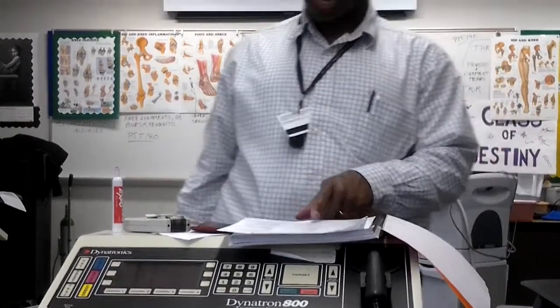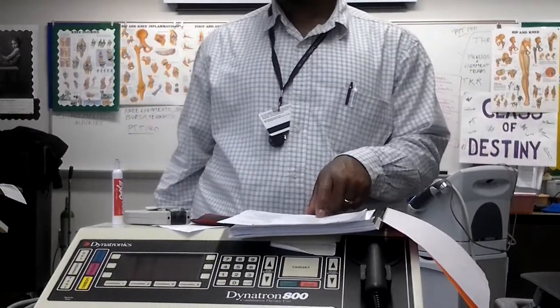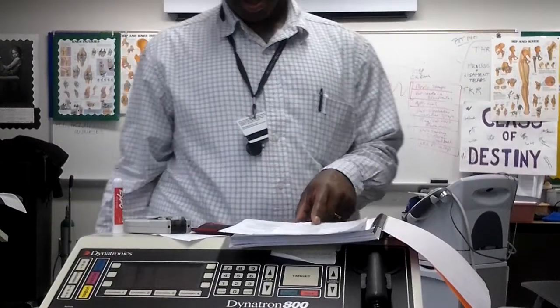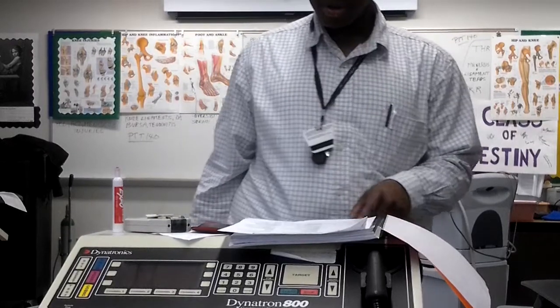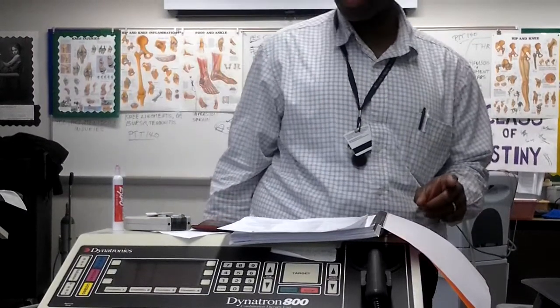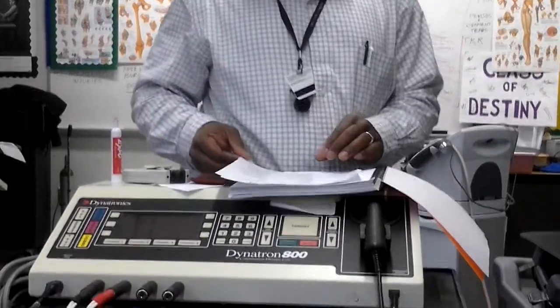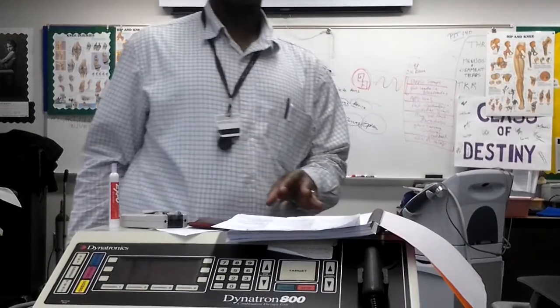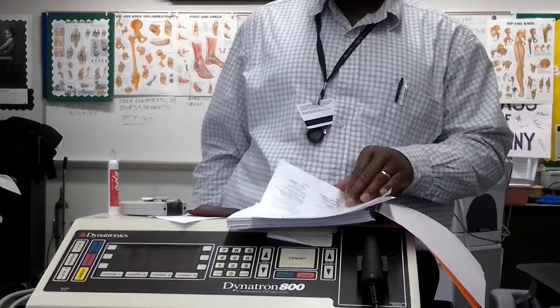All right, again, we talked about low rate TENS and conventional TENS earlier. Low rate TENS is that chronic pain protocol on page 2. And if any of these pages you don't know, ask Celia, she can tell you. And then conventional TENS is that acute pain protocol on page 2. And the parameters are there.